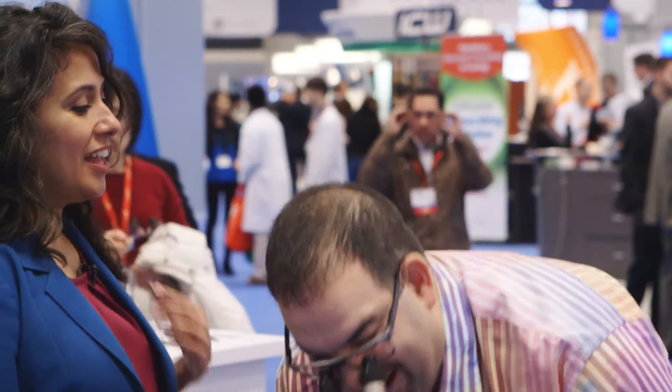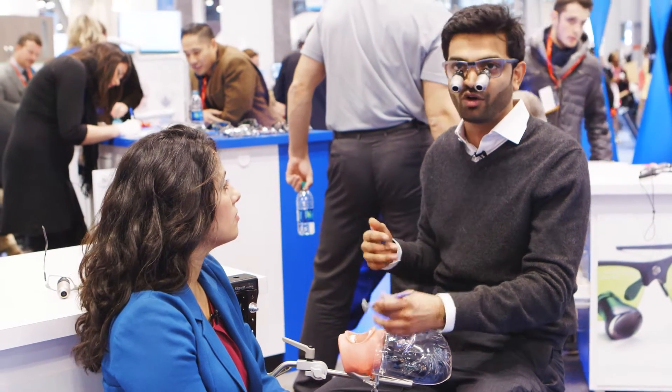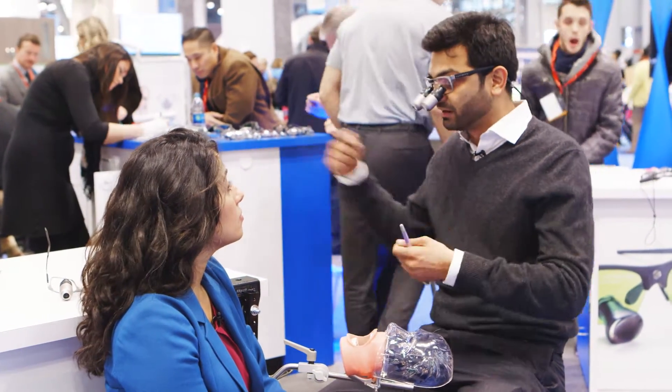There are times in your office when you need to see closer and you have to turn your head. With this, I can still maintain the working distance without straining my neck or grabbing a different pair of loupes.